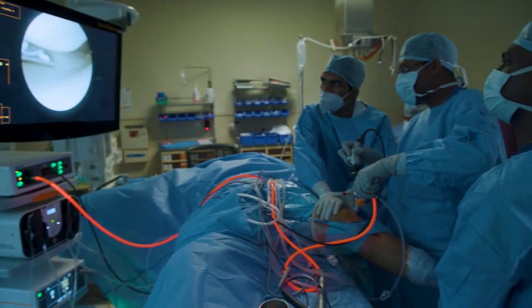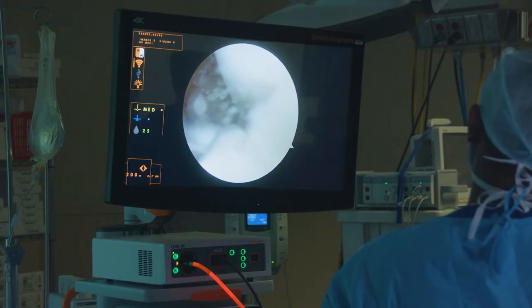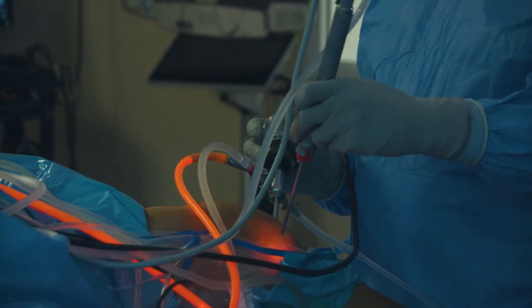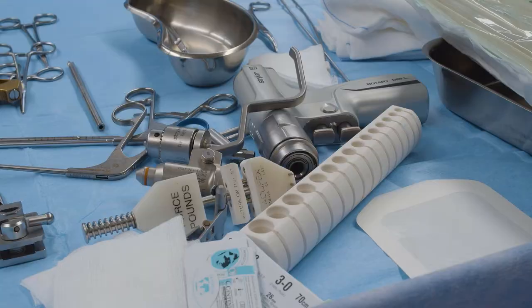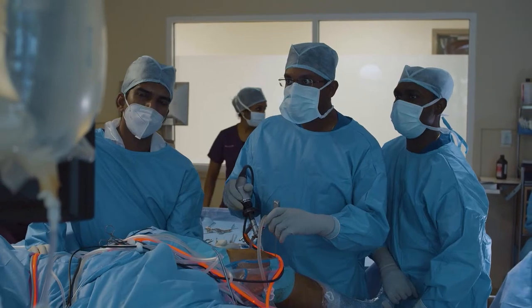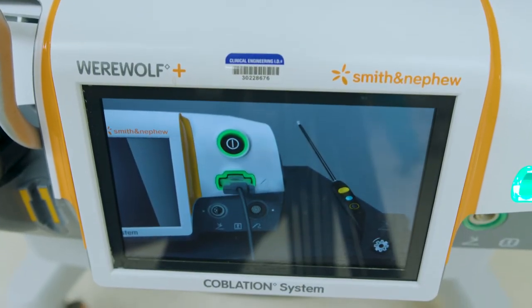When we do arthroscopic surgery in the joints and other things, in some places we have a space, and in other cases we don't have a space. So, for example, when I'm working outside the shoulder to do surgeries in the subcutaneous spaces, it's a potential space, so I need to create a space there to be able to do the surgery, and the computer assists us in that process so that it gives us the best possible and the fastest possible.